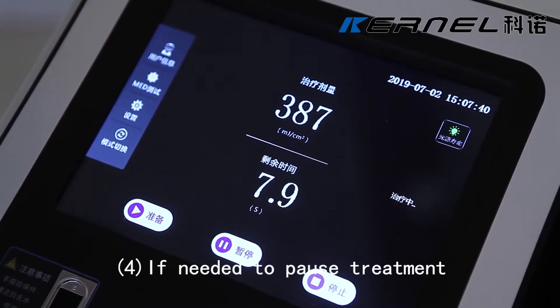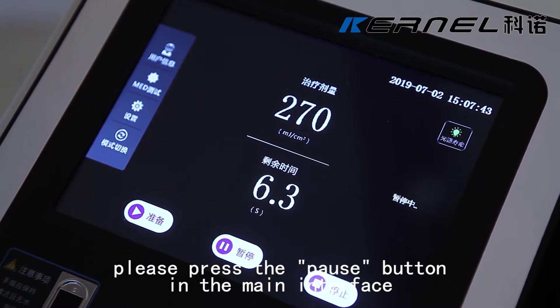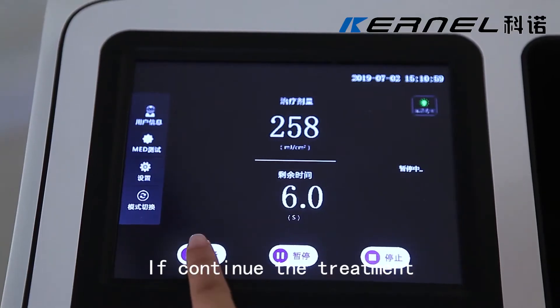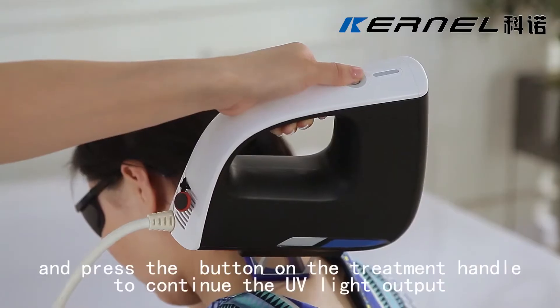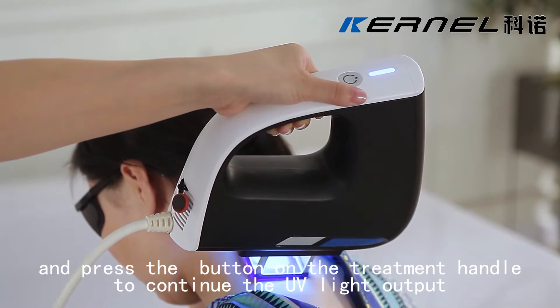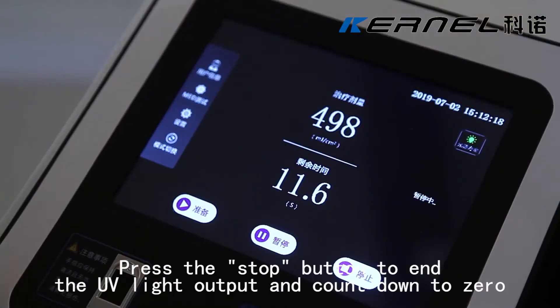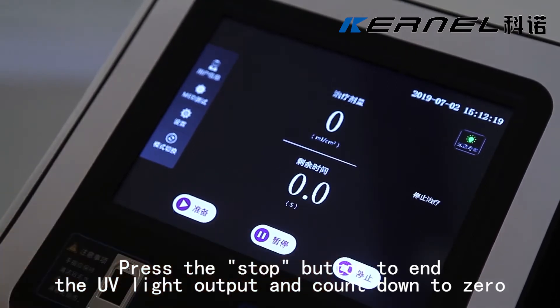If needed to pause treatment, press the pause button in the main interface to pause UV light output. If continuing the treatment, press the ready button and then press the button on the treatment handle to continue UV light output. Press the stop button to end the UV light output and count down to zero.